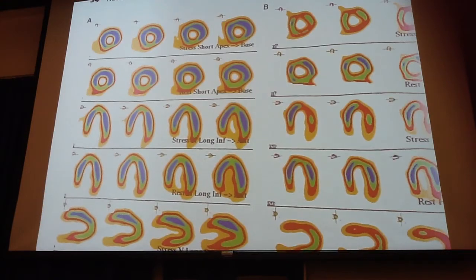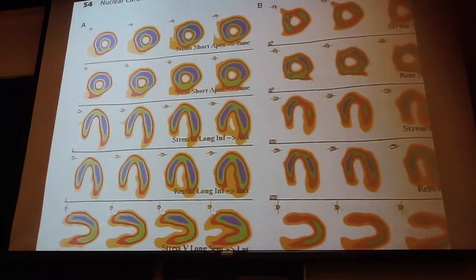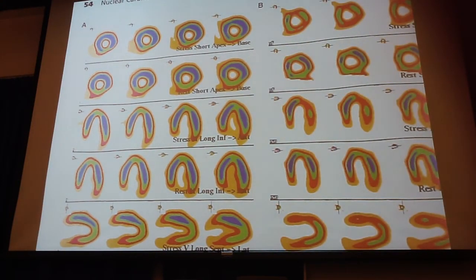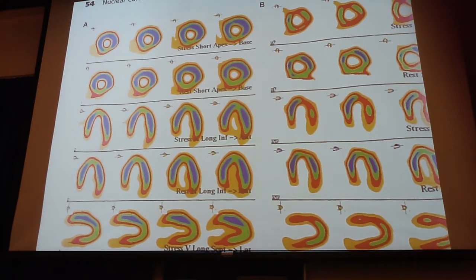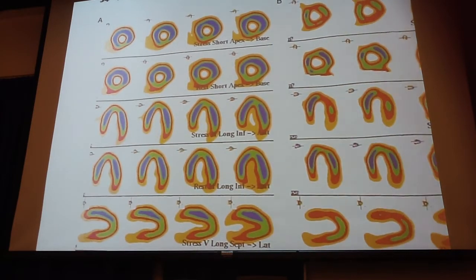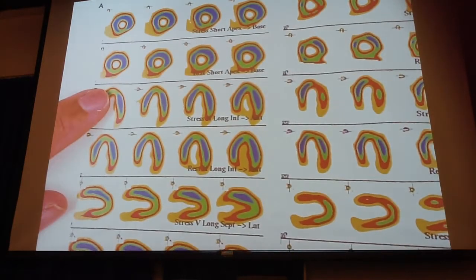So a positive would show a hot spot then? If it's positive, it would show a hot spot. So that's pyrophosphate, or indium-111 antimyosin, which I don't think we've ever had in this country. I've never seen it. But some people like these color displays.